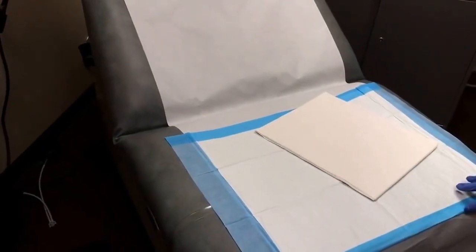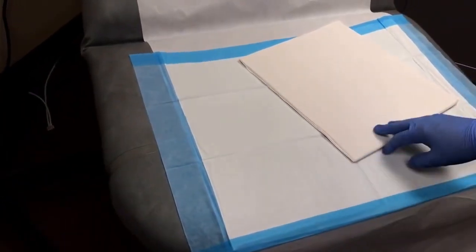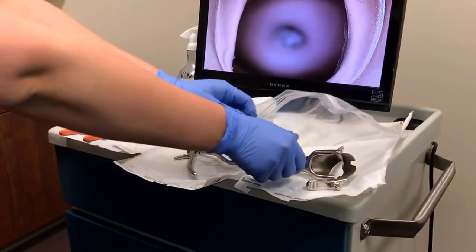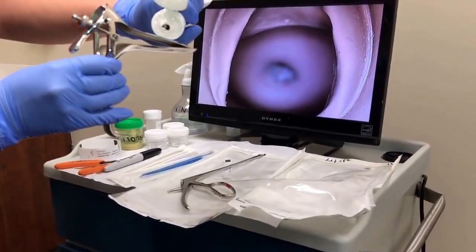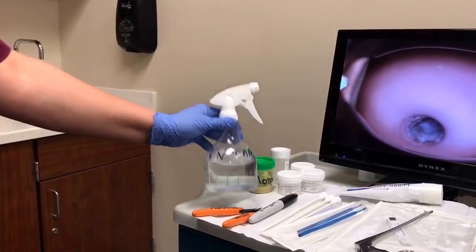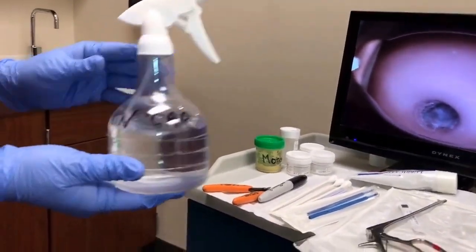Prior to the patient coming into the room, you want to make sure that you have a chucks pad on the bed and also have the drape ready. First, the medical assistant will grab the metal speculum for the provider and add a drop of lubricant. After the provider has placed the speculum, the MA will grab the vinegar solution and hand it off to the provider.